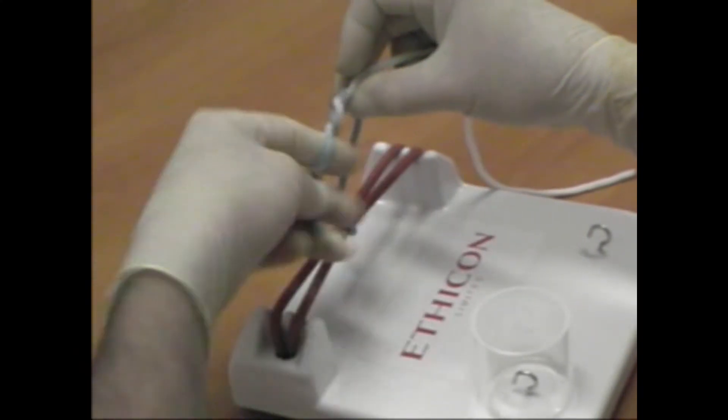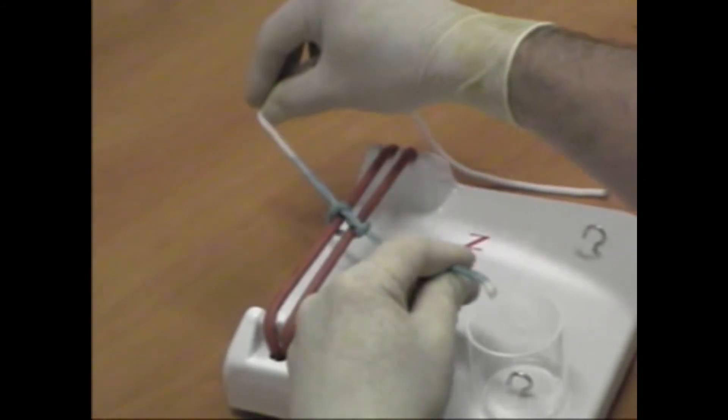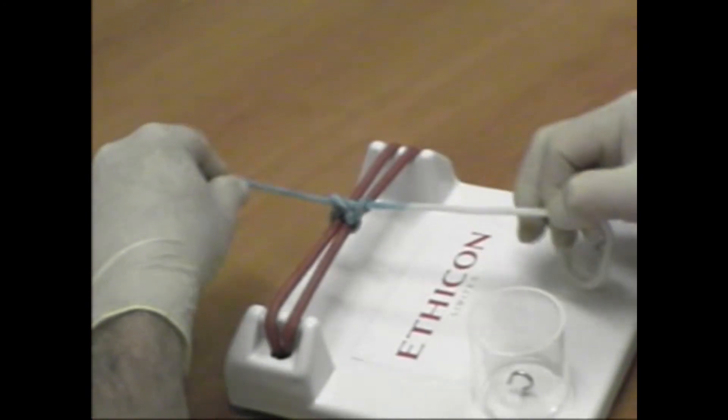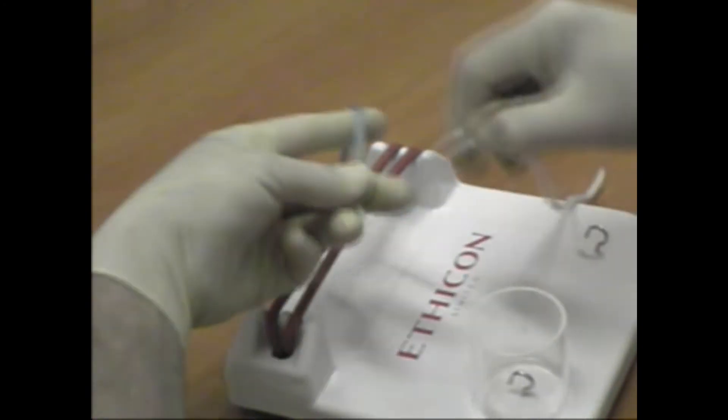The surgeon's knot gives increased security, particularly for monofilament materials such as polypropylene, where knots tend to slip. A double throw is used on the first and second ties.